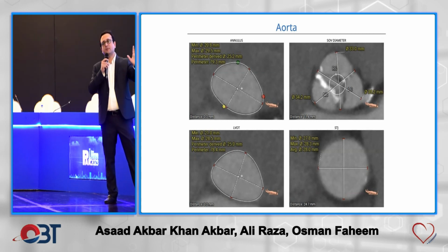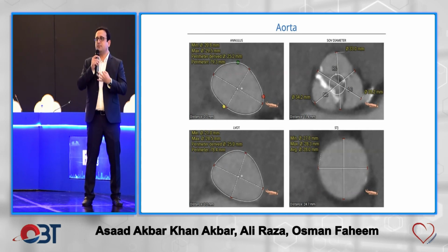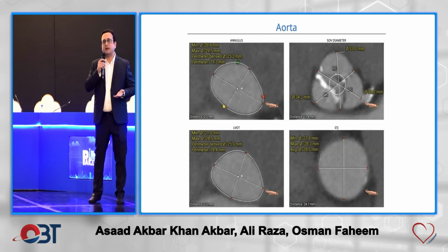So in this kind of case, where the entire raphe is not calcified, it's a pretty pliable valve for balloon valvuloplasty, and then you can deploy it. If that entire raphe was heavily calcified, probably I won't do that valve. I don't know what the others would do.